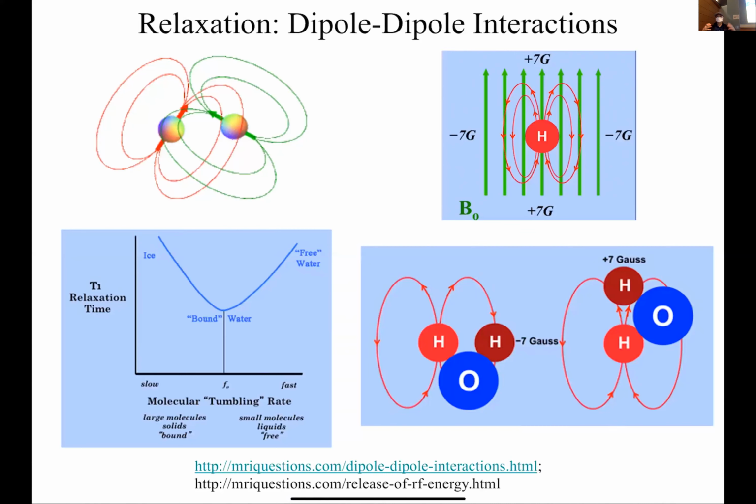And they're also going to exchange how much energy I experience. So T1 recovery has got to be when things are changing states or giving me energy that can return me back to equilibrium. Remember, to flip me away, there was energy that flipped me away from equilibrium, right? But if I just added a little more energy, I keep flipping, and if I added more energy, I can flip all the way back. So things tumbling around me can also send me back to equilibrium. They can tip me back into the equilibrium state.